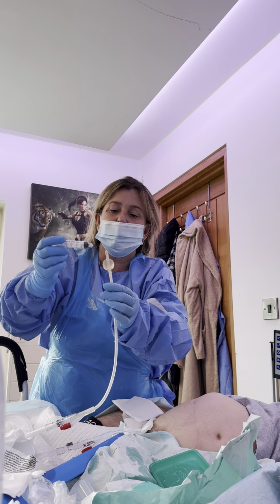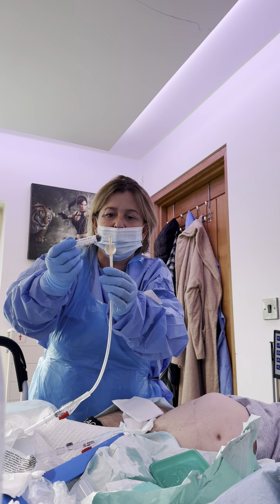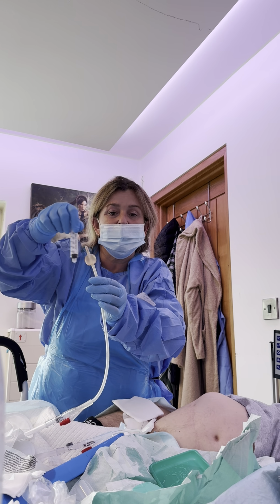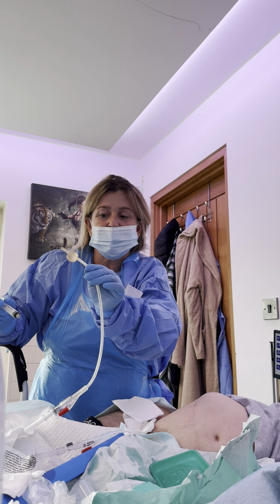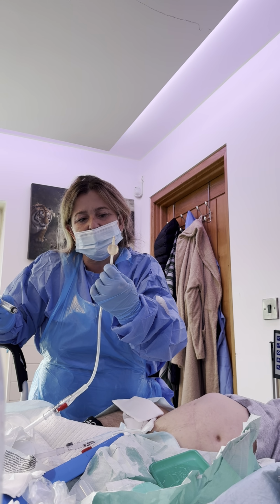So what he's talking about is you see the little hole, that's where the urine, so it sits in the bladder. So that's where the urine goes through, here and here. So we've been getting this funny smell, and the funny smell is obviously this, it's this bit. That hair, that must have come from there because it wasn't on you.